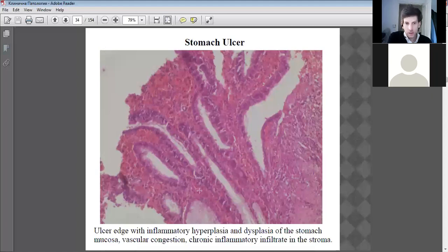And vascular congestion is occurring as well, in terms of as the cells break away, the blood vessels are getting closer and closer and beginning to form clots. You can see one example there. One example is there, the vascular congestion. Other examples up here.